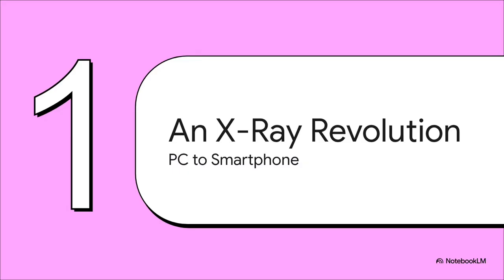And look, this is not just some minor upgrade. The leap here is like going from one of those giant, clunky desktop PCs of the 90s to the smartphone that's in your pocket right now. It fundamentally changes everything: the workflow, the accessibility, and especially the patient experience.